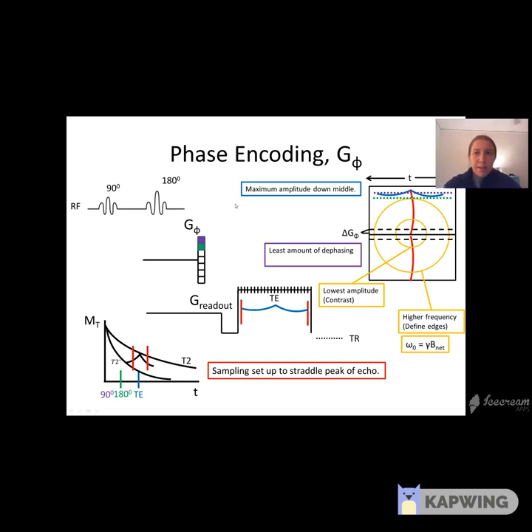First I just want to recap from my last talk, because I was talking about how we fill K-space. We send in a 90-degree pulse, use the slice select gradient just to image a slice in the patient's torso, for example. And then we can apply a 180-degree pulse, or not.